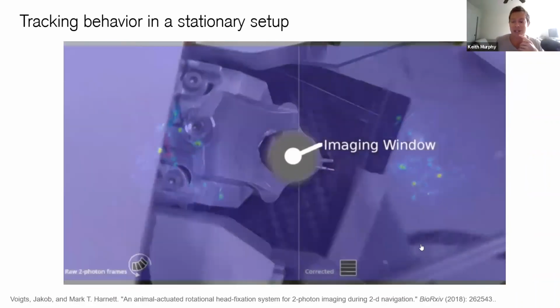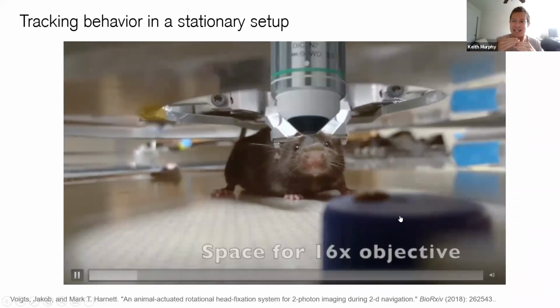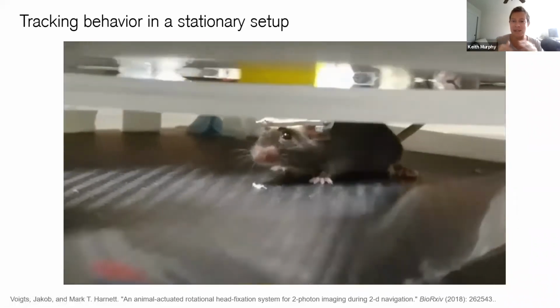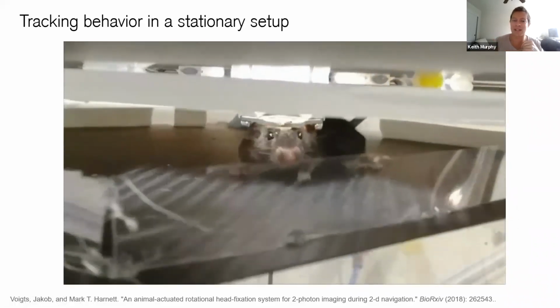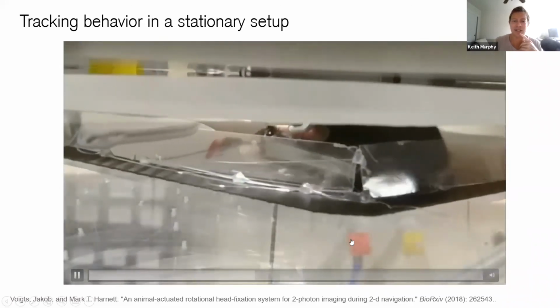Yeah, and if you can notice, underneath the animal is a sort of floating disc. It's an air hockey table, so that the animal can push this thing underneath them with very little effort. You can see the little dots in the table flowing air onto this hockey puck.